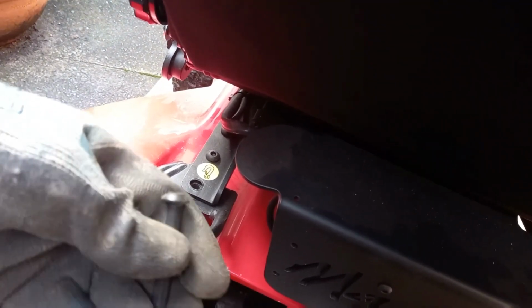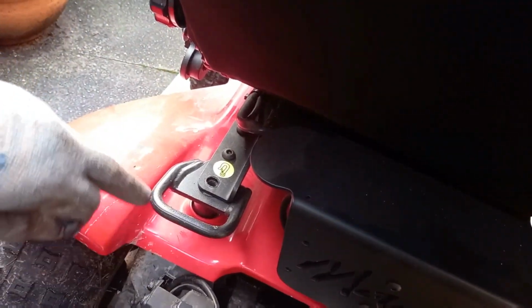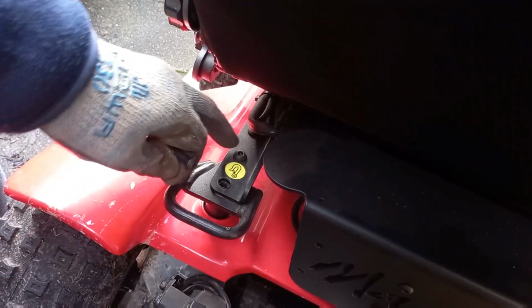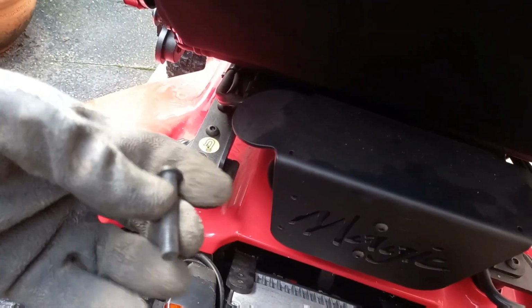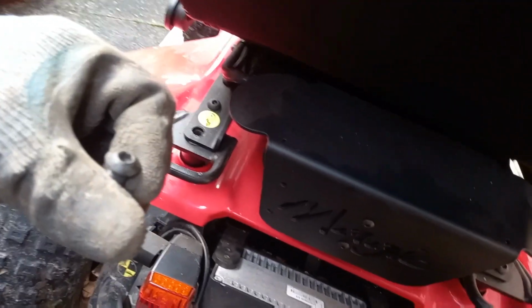Yeah, but all of the fasteners, if you notice, look, that one that holds this fastening attachment point there, that's exactly the same. They're all exactly the same. They all use this type here. Well, to be honest, I actually think, unless they're special... Shall we just get on with the job in hand?